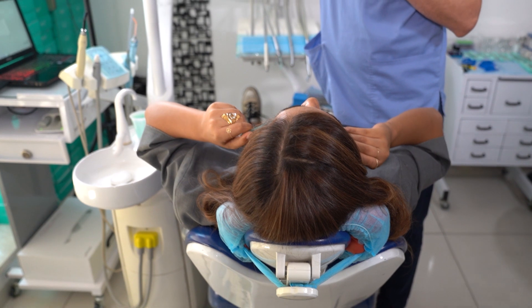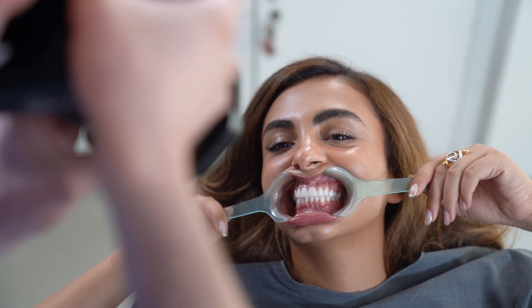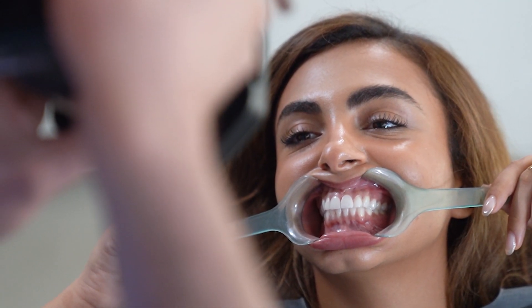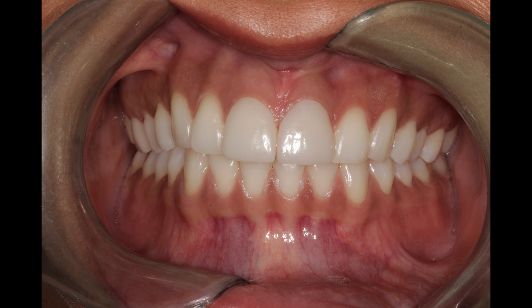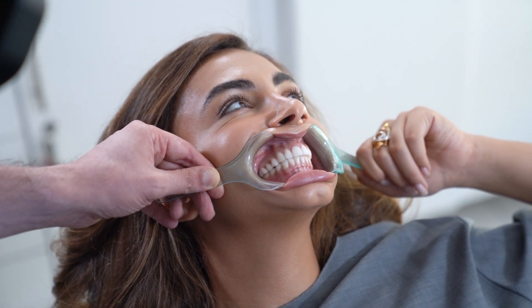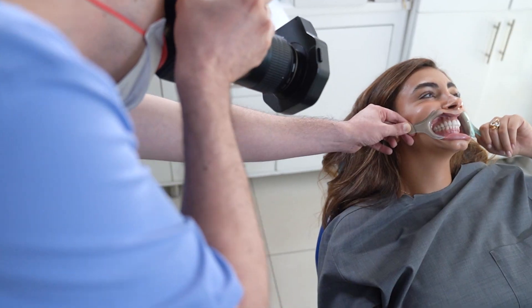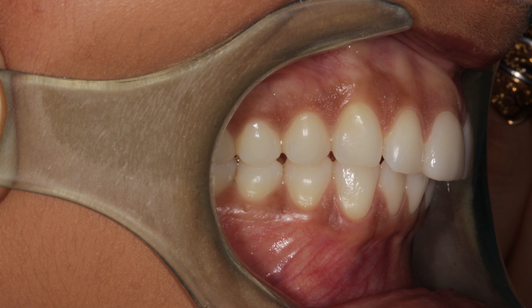When you are done with extraoral shots, seat the patient back in the dental chair and use retractors to retract the patient's cheeks. Ask the patient to bite in centric occlusion and start with the frontal shot. For this shot, position your camera parallel to the occlusal plane, making sure all teeth are showing. Once done, move to the right buccal shot, trying to retract the cheeks to show at least the mesiobuccal part of the first molars. Position your camera parallel to the occlusal plane and as far back to the right buccal area as possible.